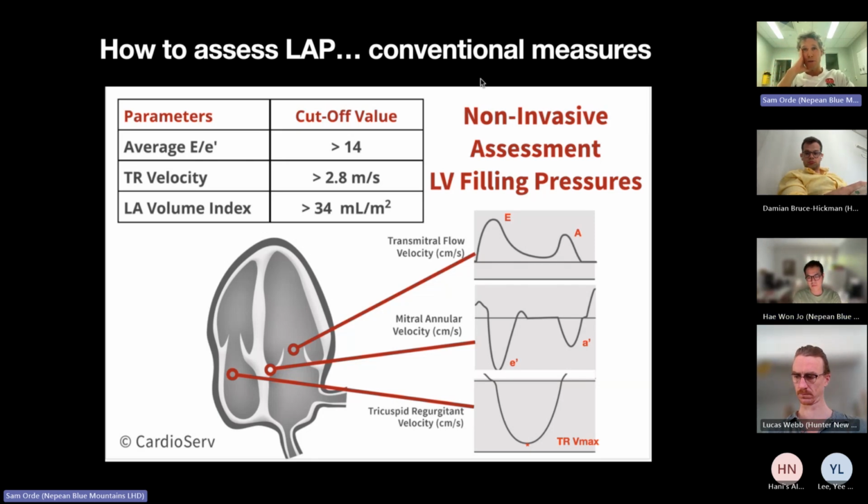So I'm very deliberately not talking about diastolic dysfunction because I don't think it's that clinically important whether you've got someone who's got grade 2 or 1 diastolic dysfunction. I think it matters whether they've got raised left atrial pressure or not. And more importantly, I don't think I've got a lot of great evidence. The ICU literature is pretty scant, I'll be honest, and I'll present some of the best papers I think are out there. But am I wrong in this? We're all pretty experienced clinicians on here. I think that's what we care about, right? It's left atrial pressure, not diastolic dysfunction.